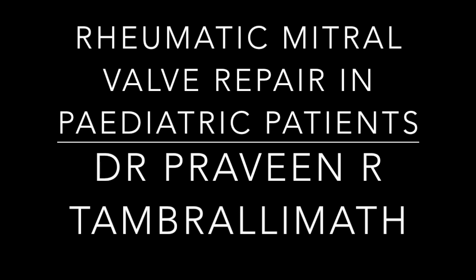In this video, I would like to present mitral valve repair in rheumatic heart disease in the pediatric population. In Southeast Asia and the developing world, rheumatic heart disease is the most common cause of mitral valve pathology and can be seen in pediatric patients as early as 5 to 6 years. With this video, I would like to show two cases of mitral valve repair techniques which can be helpful for other cardiac surgeons.